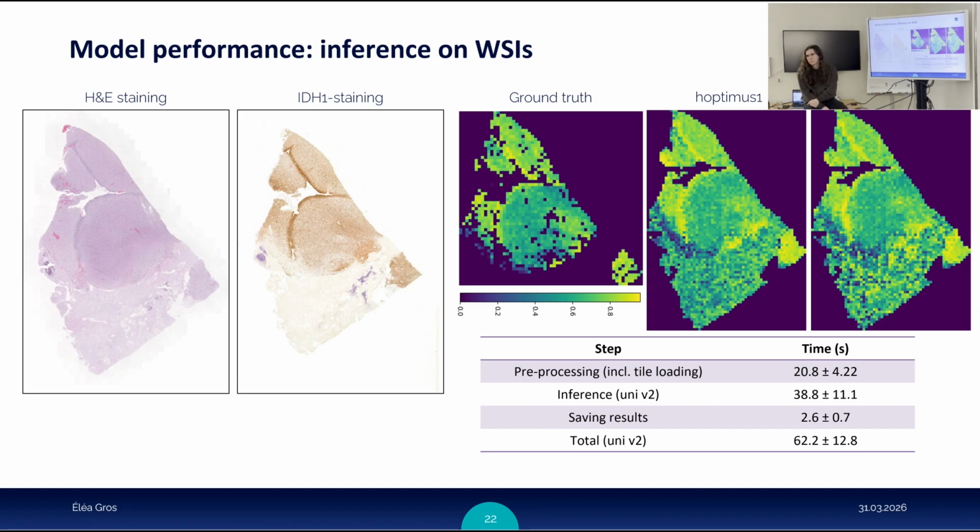Okay. So you would like to have in this kind of diameter the information of what's the tumor cell content. Yeah. But the important thing is that the overall tumor cell content is higher than the minimum threshold. Yes. And maybe there's variation across the patches, but if you average across it, you see, okay, here is the area that's most likely to contain the highest. You want to have the area with the highest tumor cell content. Yes, you want to avoid areas that have less than 70 or less than 50, let's say.